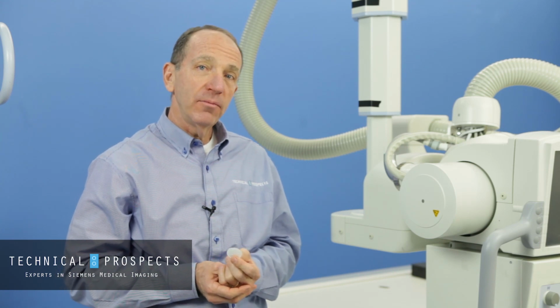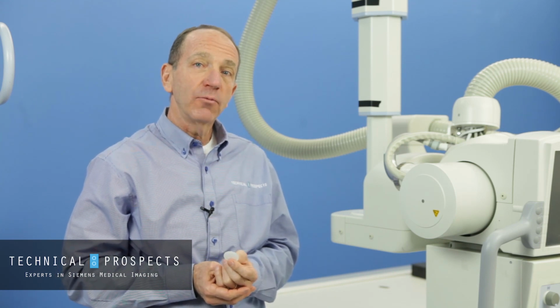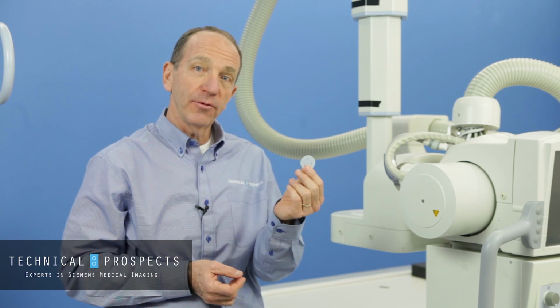Today, we're going to talk about changing the coronal discs. Whether you're replacing an X-ray tube or performing preventive maintenance, which is every 2 years for an X-ray product, you're going to want to replace the coronal discs.